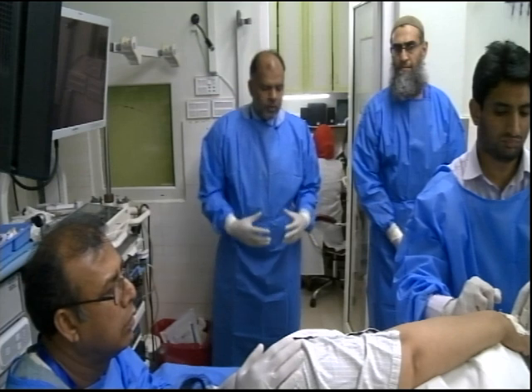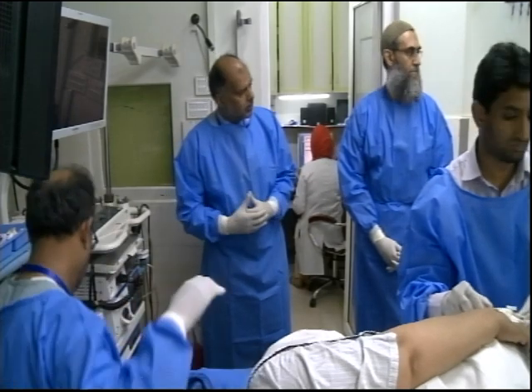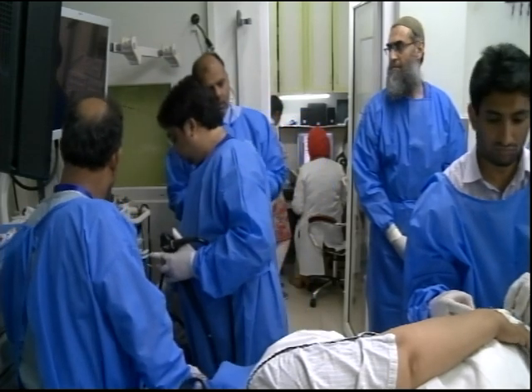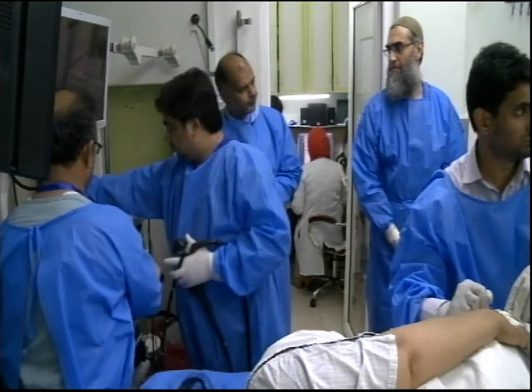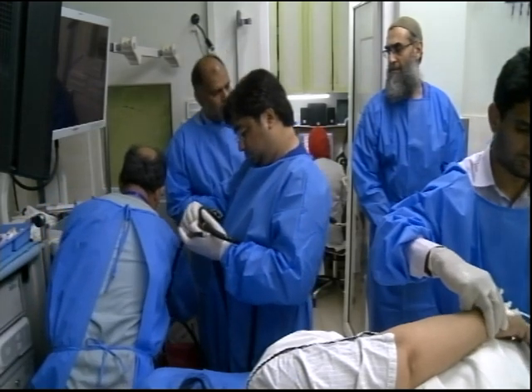Which scope should you use? Would you use a linear scope or would you use the other scope? Generally, we use a linear scope. For the lesion in the stomach, would you prefer a radial scope or a linear scope? We don't have any experience with the radial scope. Generally, we do all our examination with the linear scope. Okay, that's what practically is.